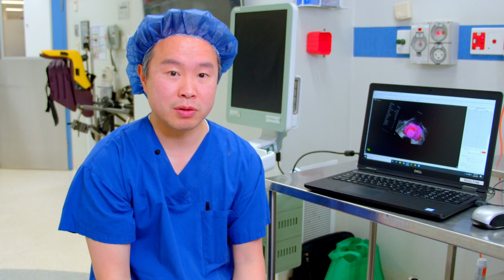So today we're going to show you a prostate biopsy. Prostate biopsy involves putting a needle into the prostate and taking a sample of tissue, which is then examined for evidence of appearance of prostate cancer.